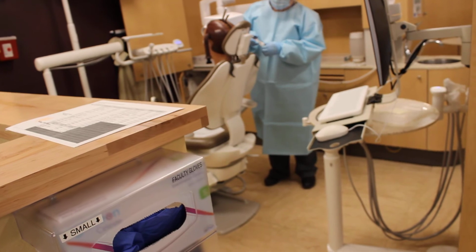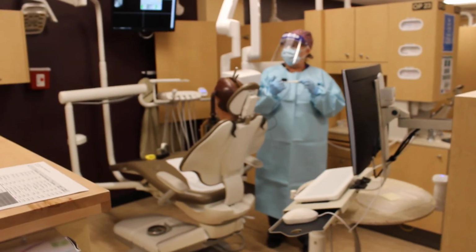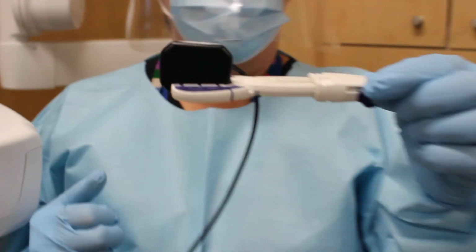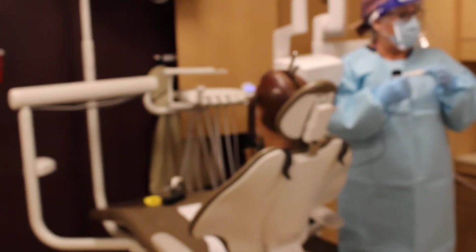When you set this up, you have this little blue line on your Snapper. And that's going to be your guide when you place this in the mouth. I'm going to just zoom in on that blue line there. When the patient bites, you're going to have this blue line visible.